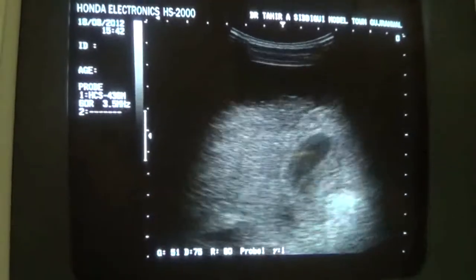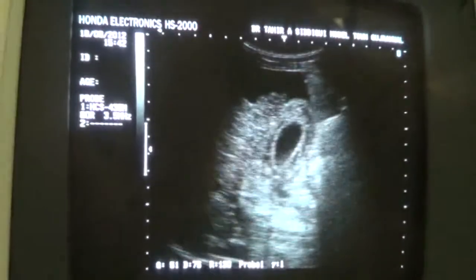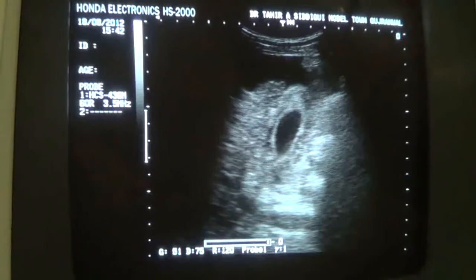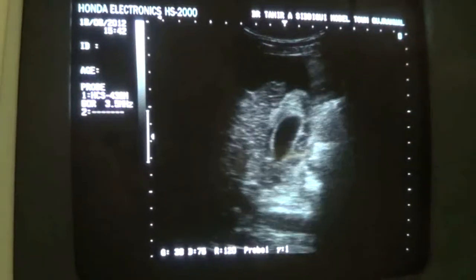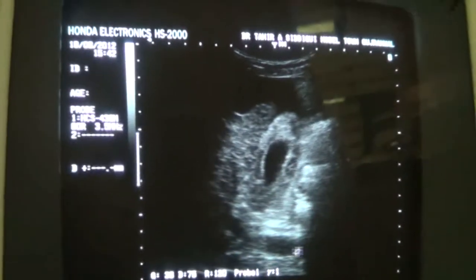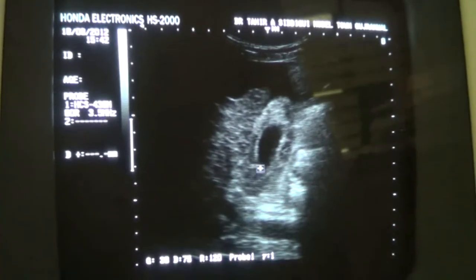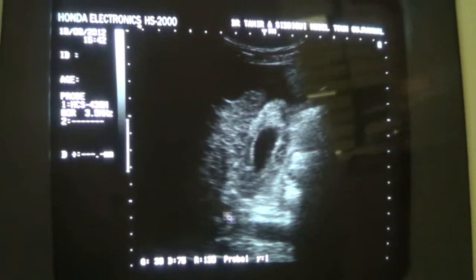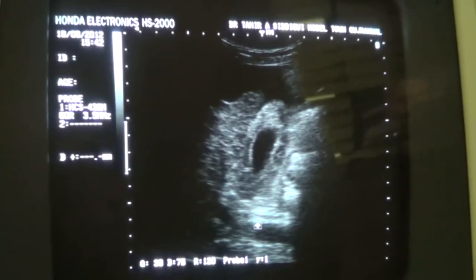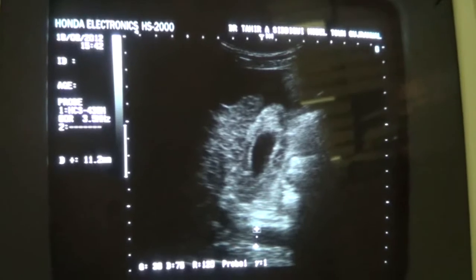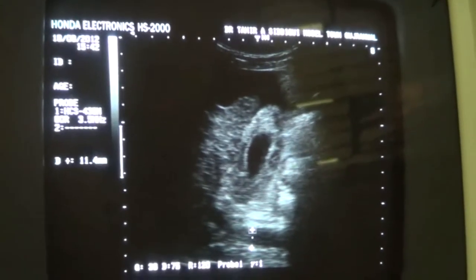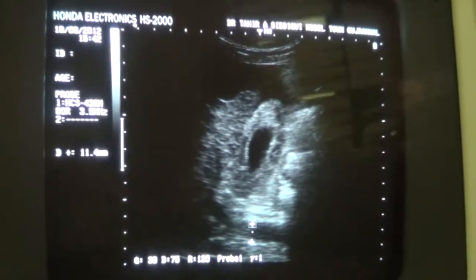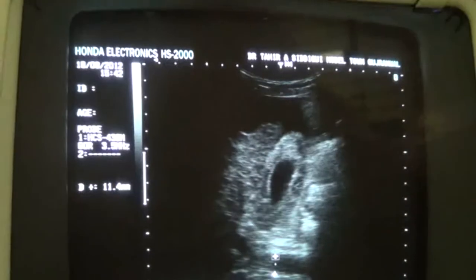In such cases we always look at the portal vein. Now this is the portal vein, running at right angles to the neck of the gallbladder. The portal vein measures 11.4 millimeters. The normal should not exceed 13 millimeters, so it is within normal dimensions.